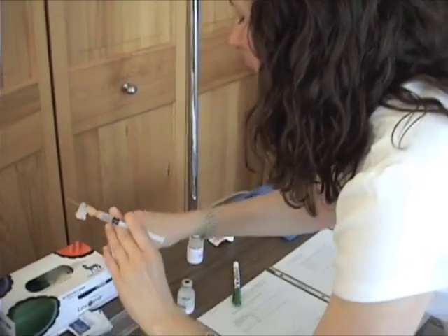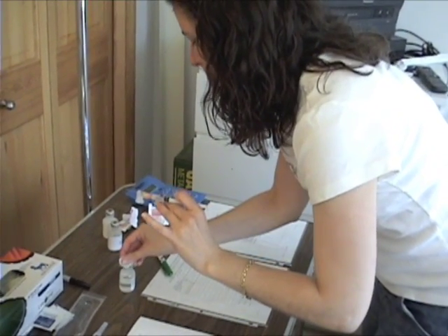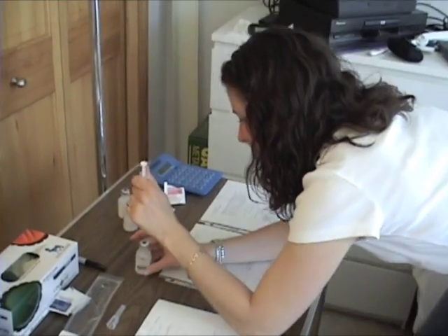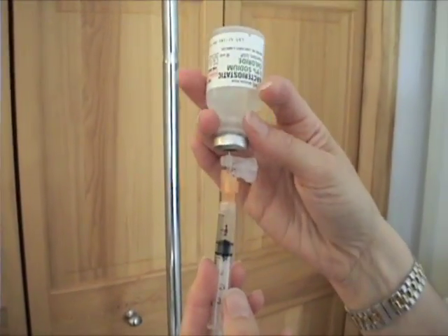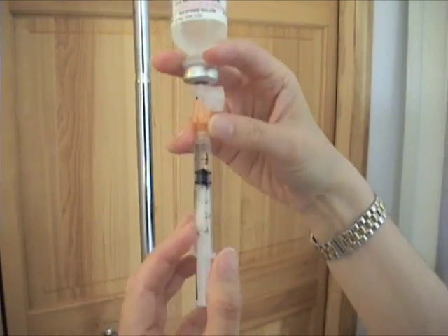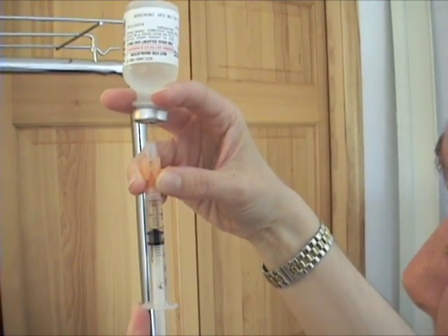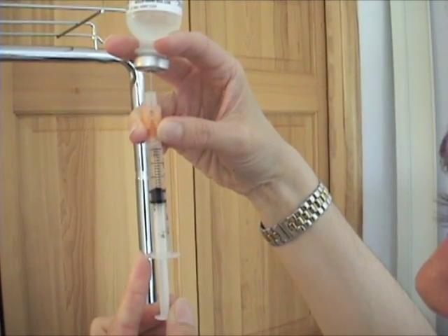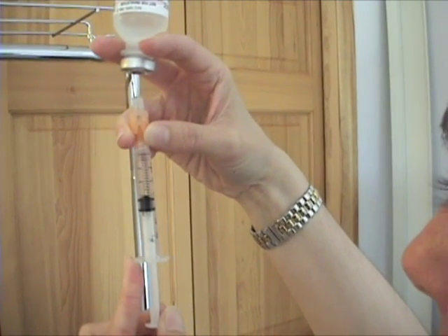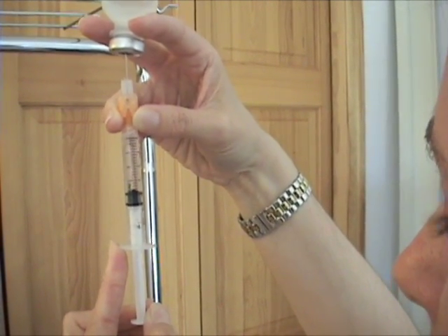And now we're going to go into the second vial. I like to clean it again. And then in and up, just very slowly. If you go really slowly, there's less chance that bubbles are going to build up. That was what I found out. If you go fast, there's more chances of bubbles. So you see, go very slowly, there's no bubbles, and make sure you stop at the 2 milliliters. There we go. Okay, that's done.